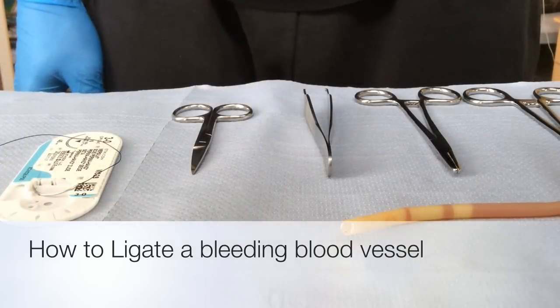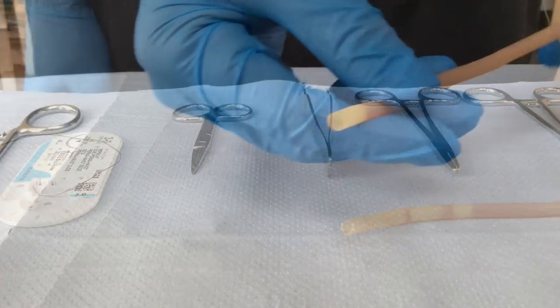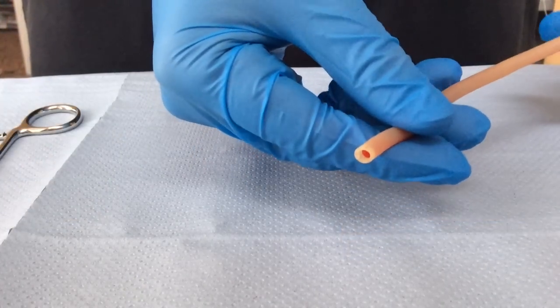In this video I am going to teach you how to tie off or ligate a bleeding blood vessel. This is to demonstrate a bleeding blood vessel.